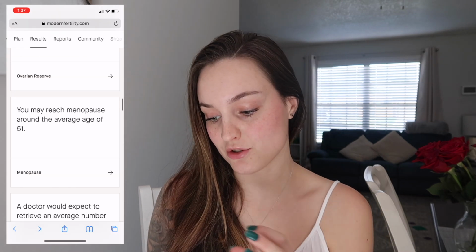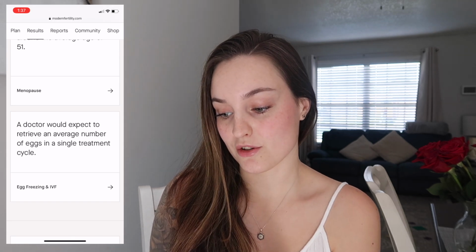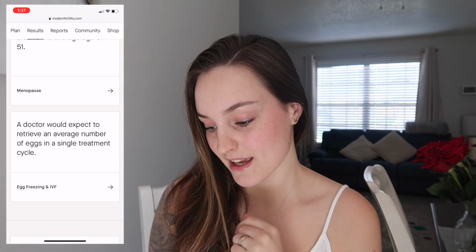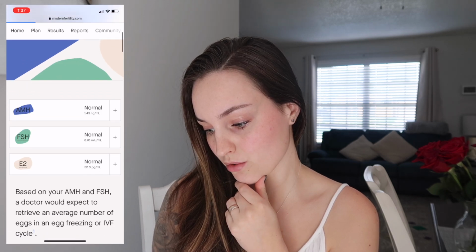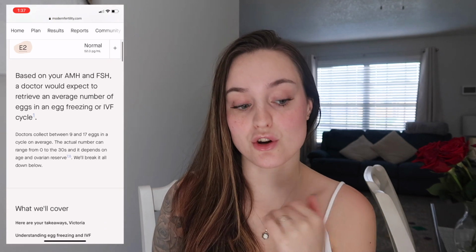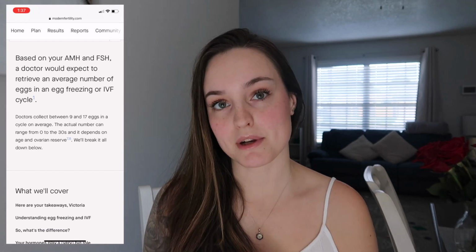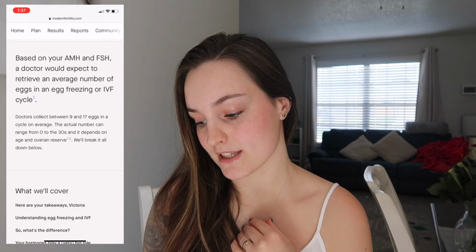So if I was looking to do egg freezing and IVF, it says that a doctor could get an average number of eggs out of me, which is great. Let's see, egg freezing and IVF. They are all normal, which is great. I don't plan, like I was saying in the beginning of the video, we're trying now for baby number 2. I think we only want 2 children, so I'm not really thinking of egg freezing.